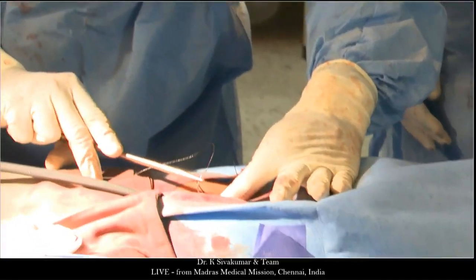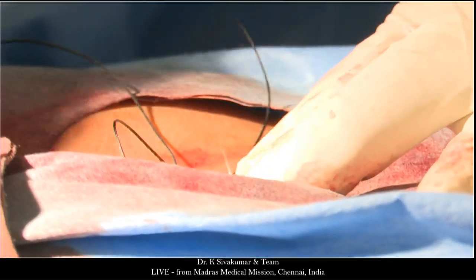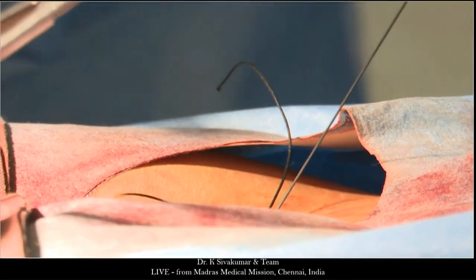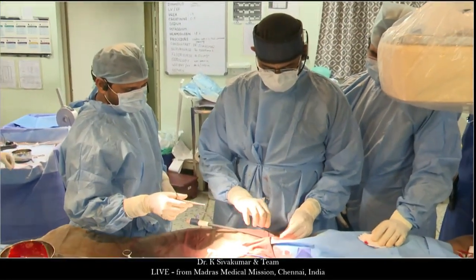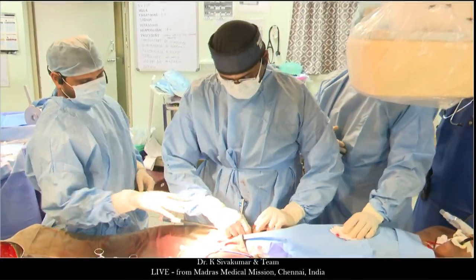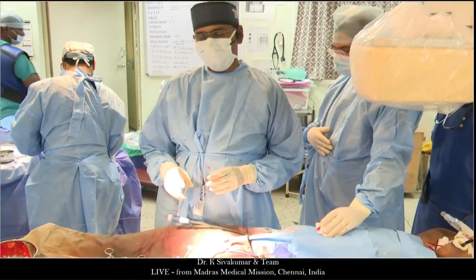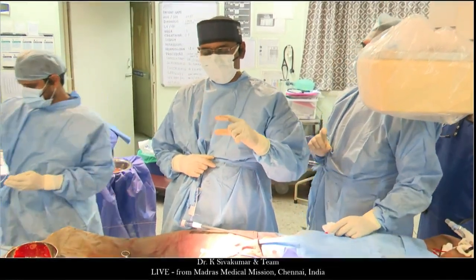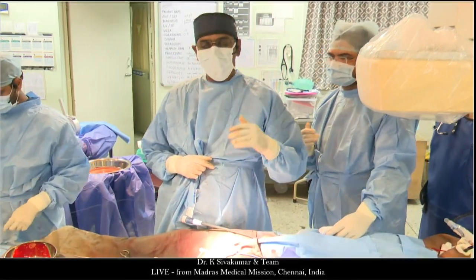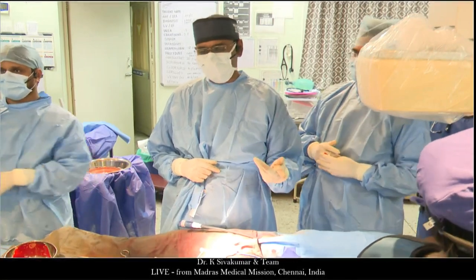We have written in our original paper in Circulation Interventions that if there is a substantial caudal extension of a sinus venosus defect, patients are less likely to be completely occluded. The definition of a caudal extension is this: take the transverse diameter of the superior cavoatrial junction and compare it to the vertical extent of the sinus venosus defect from the cavoatrial junction on a transesophageal echo. If the vertical extent is 1.5 to 2 times the transverse diameter, then these patients are going to be difficult to close.